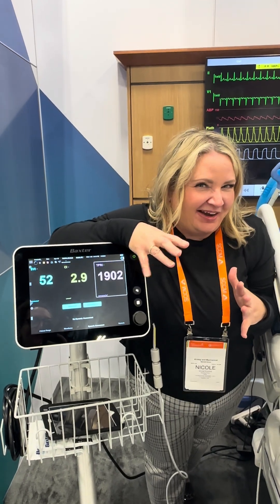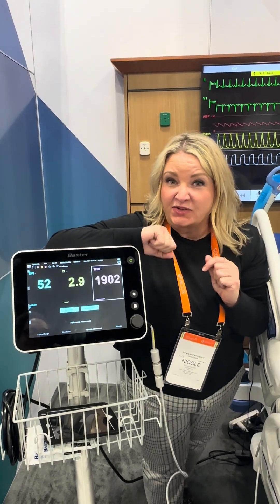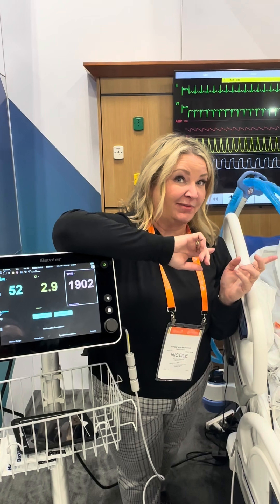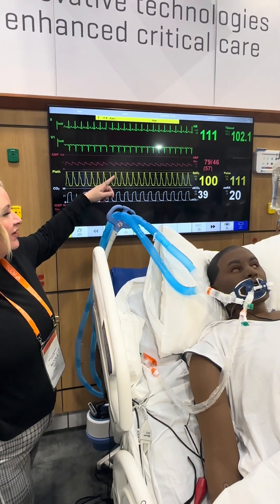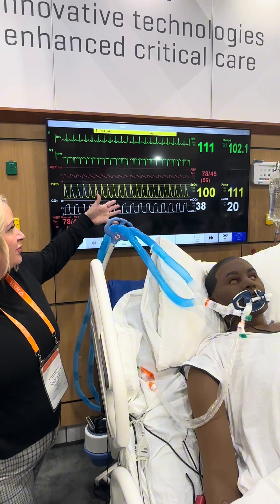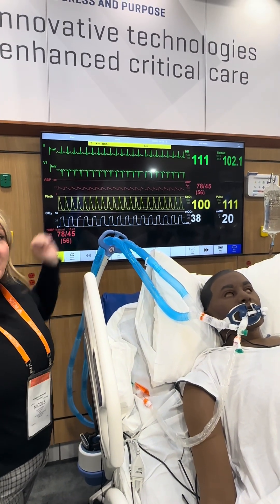We've got a case scenario here. You've got a patient who's septic, who's got pneumonia, who's intubated, and now let's check out their monitor. You can see the heart rate is 112, the blood pressure is 78 over 45 with a MAP of 56.